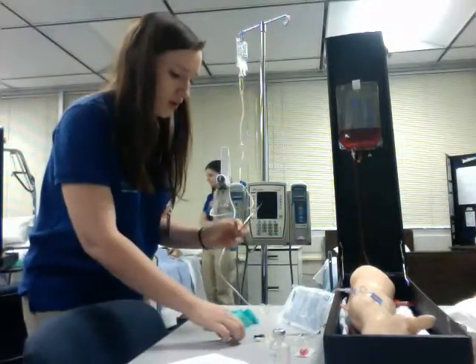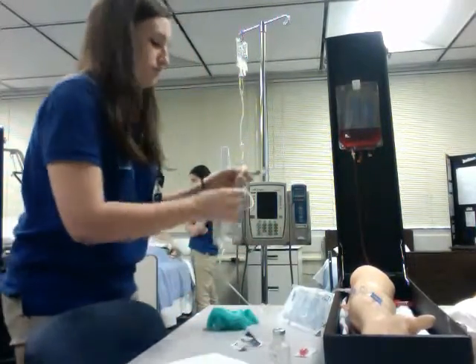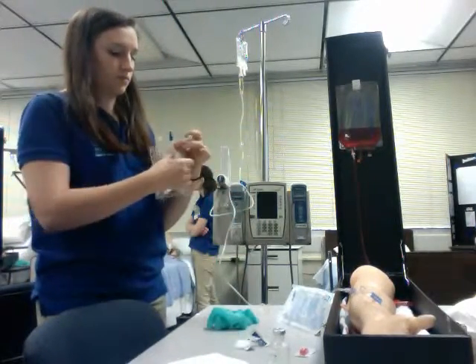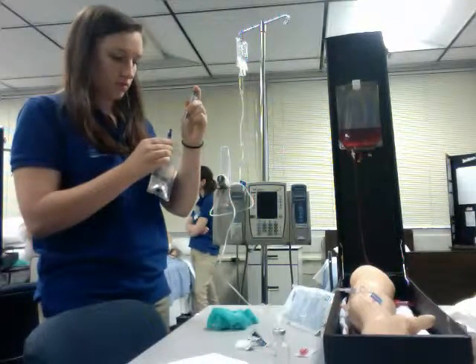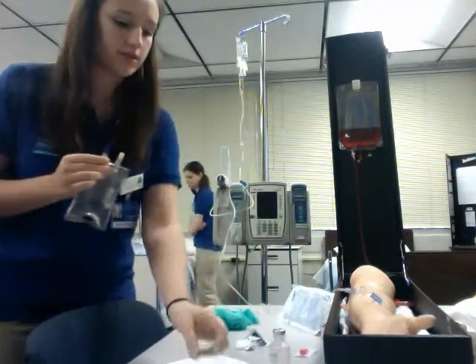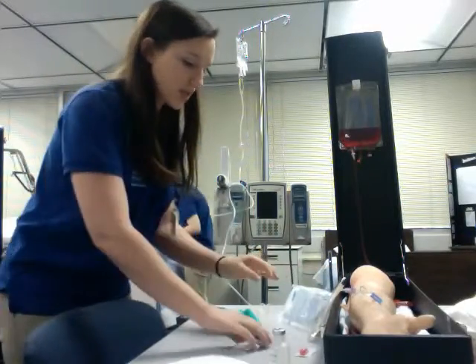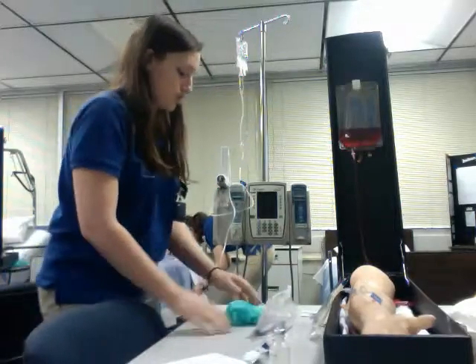And now I'm going to go ahead and put it into my saline. So I have to fill up the medication, basically 6 milliliters, and then put it in. This is easy. Okay. Alright, and then I discard this into my sharps container. And I've got all this ready, so now I'm going to take my medication, my alligator clamp, and my tubing into the patient's room.